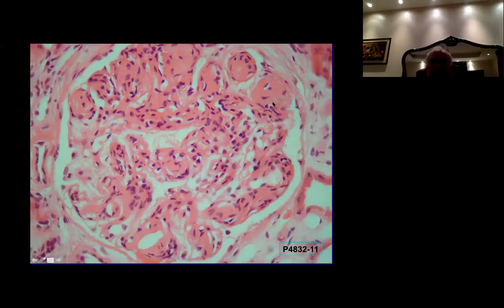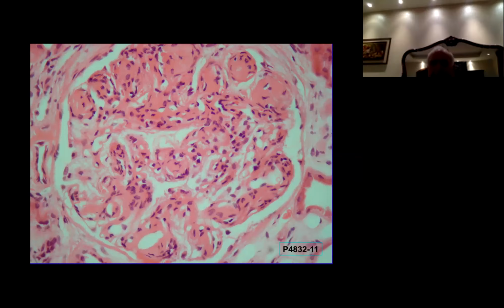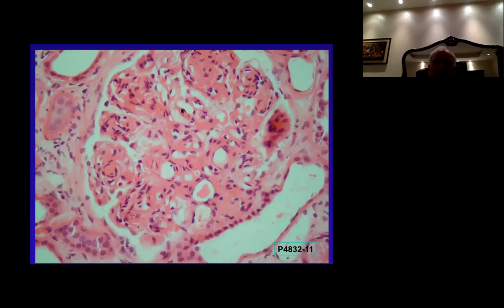of glomerular injury. You have to remember, with a nodular pattern we have diabetes, we have amyloid, and we have light chain deposit disease, okay? And that's more important. Look at this, it's exactly the same. Increased cellularity. The capillary loops are not that bad.